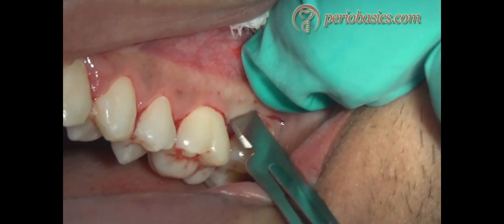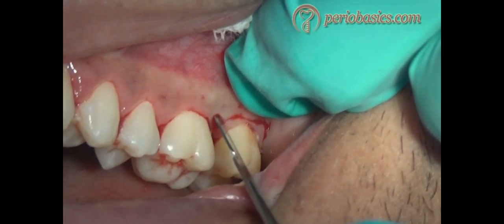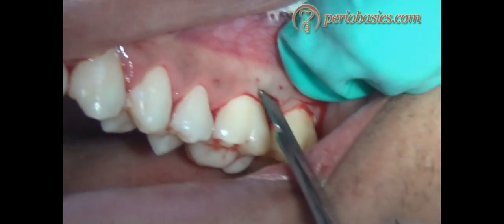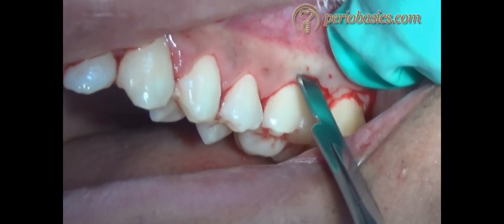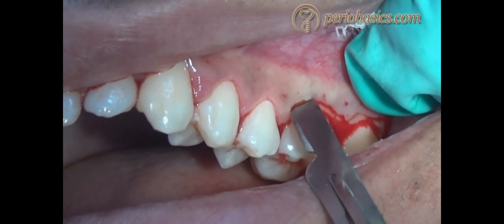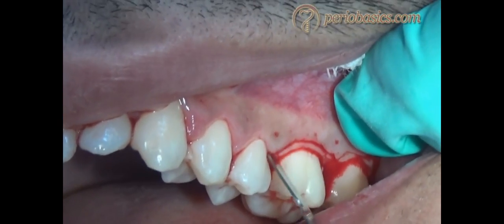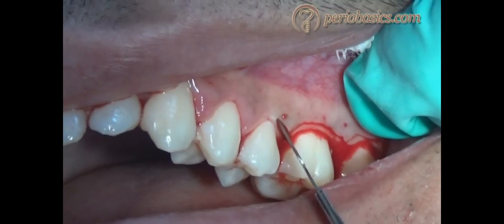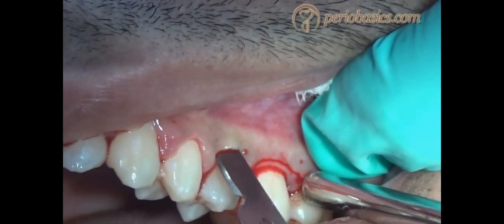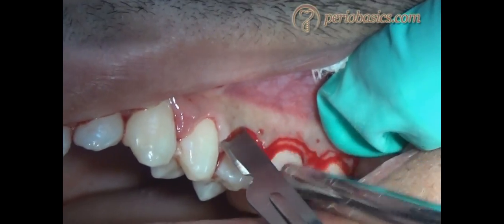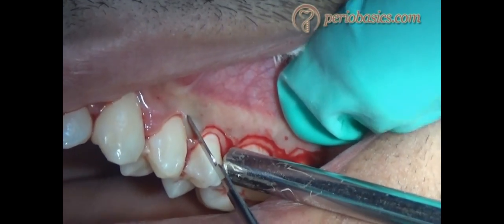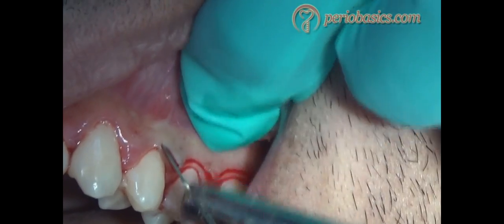You can see that the blade has been placed at around a 45-degree angle to the tooth surface. We put this incision 0.5 to 2 millimeters away from the gingival margin towards the alveolar crest. The thickness of the incision can be varied according to the thickness of the gingiva in that area.